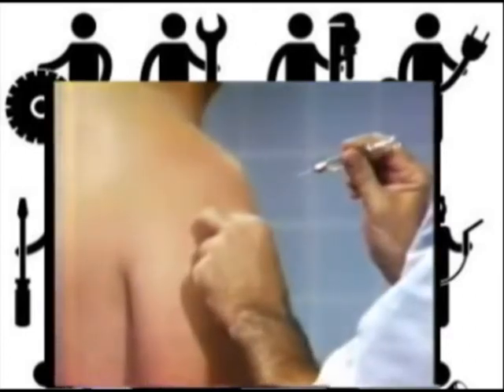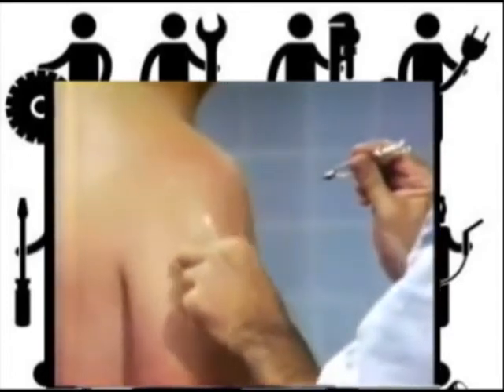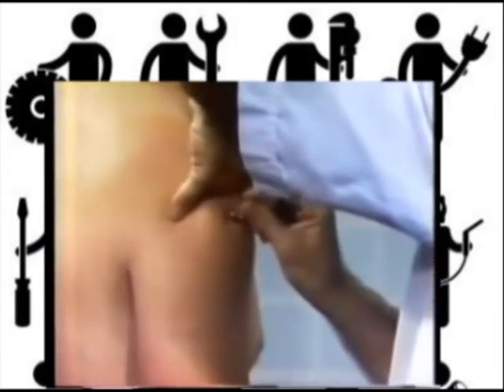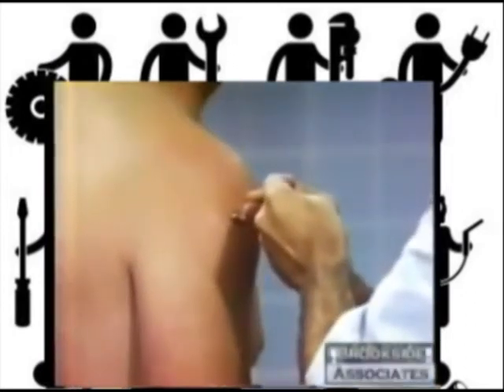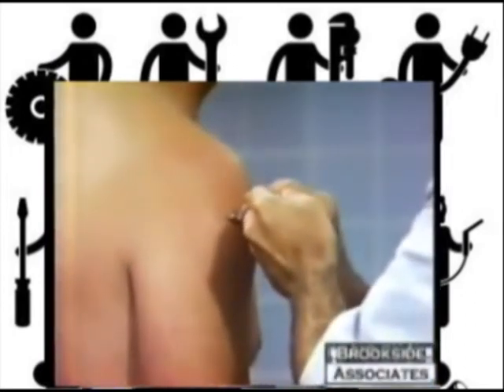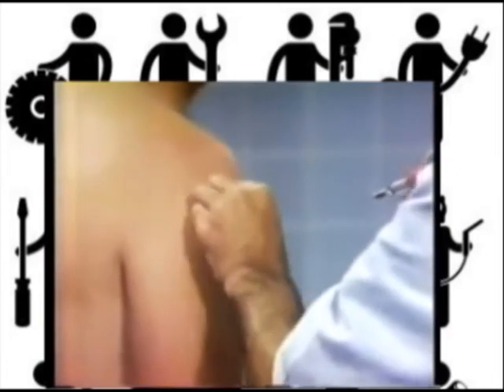Remember the principles. Clean the site, firm the tissues, inject at a 90-degree angle, aspirate, inject the medication, withdraw the needle and syringe, and massage.